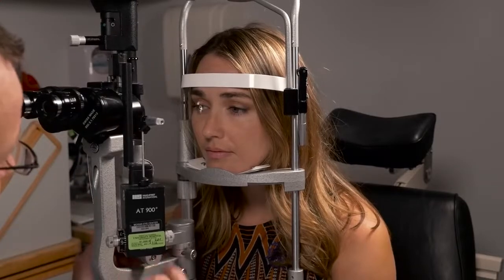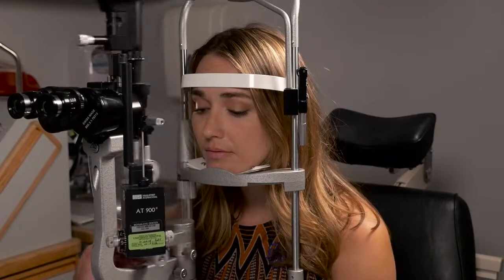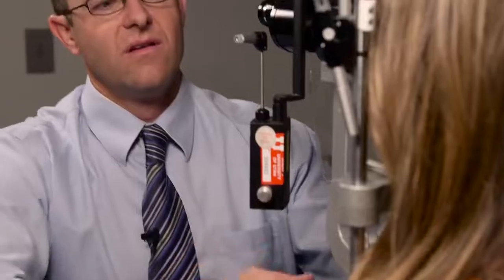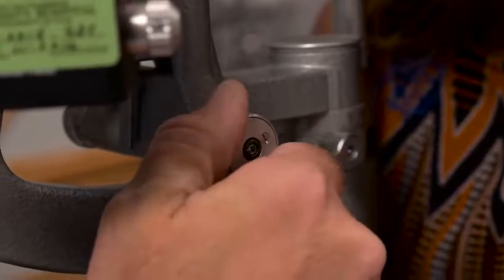Also on the slit lamp, these are the main two knobs you're going to use. This upper knob controls the lateral movement of the beam, the side-to-side movement of the beam. It also increases the width. By spinning the knob, you can go all the way in and all the way out and spin it all the way around, and you widen the beam. At different parts of the exam, you're going to widen or narrow the beam depending on what you're looking at.